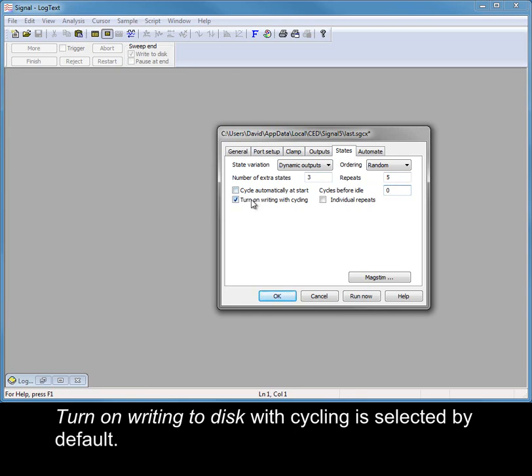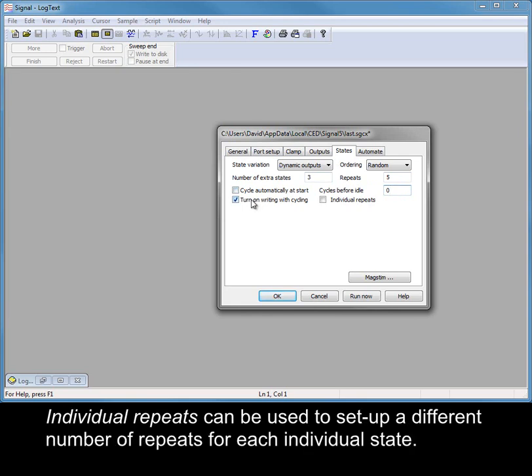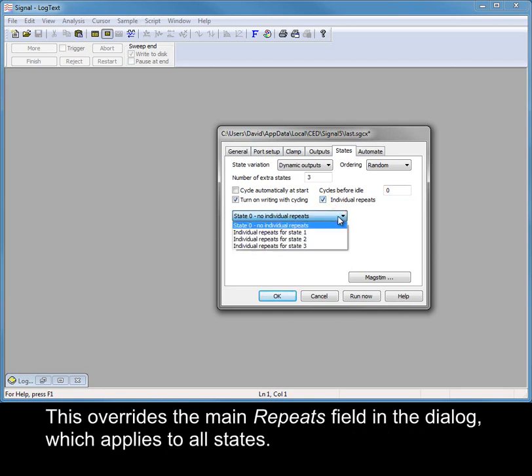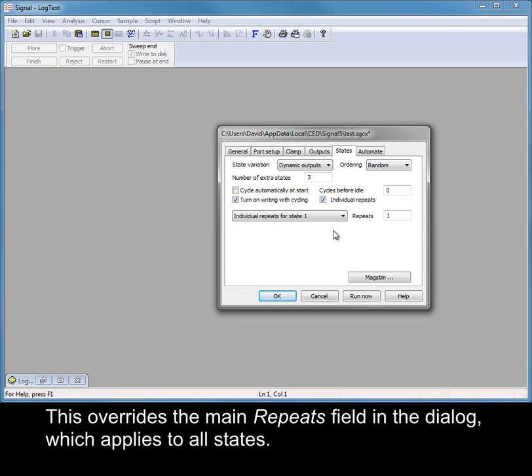Turn on writing to disk with cycling is selected by default. Individual repeats can be used to set up a different number of repeats for each individual state. This overrides the main repeats field in the dialog, which applies to all states.